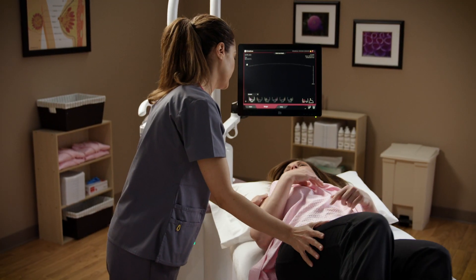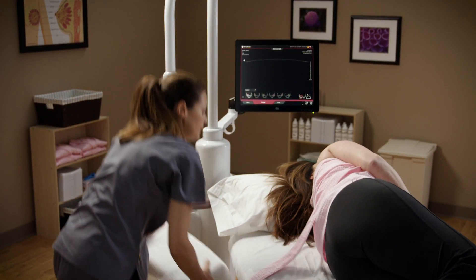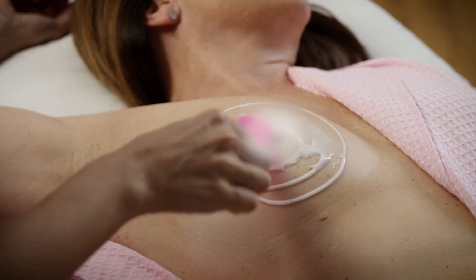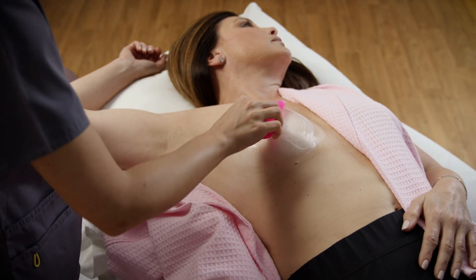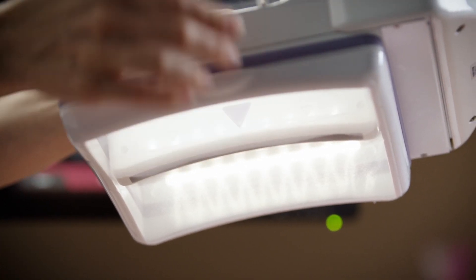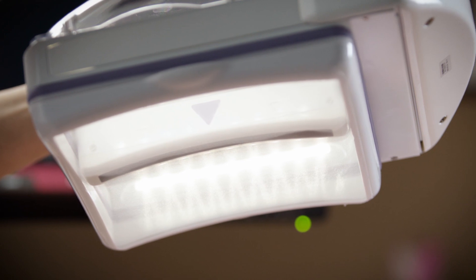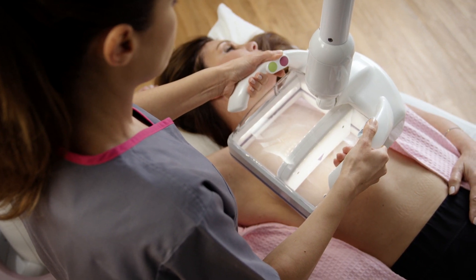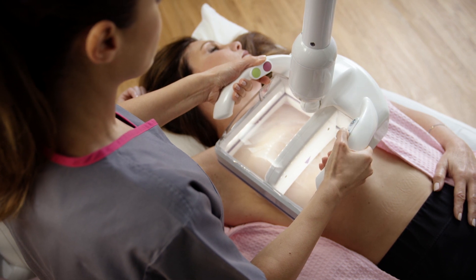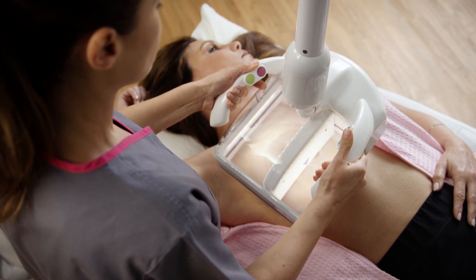You will be asked to lie on your back and be placed in position for the exam. Ultrasound lotion or gel will be applied to your breasts. A mesh membrane will cover the scanner — a new membrane is used with each patient. The operator will place the scanner on your breast and apply gentle pressure to help ensure contact with your skin on all sides.